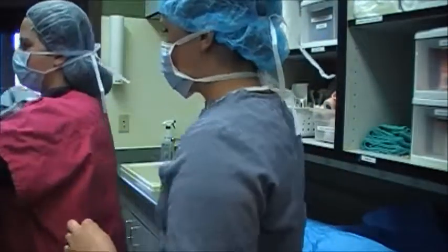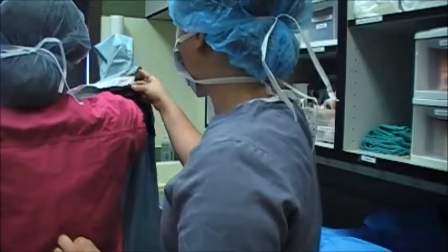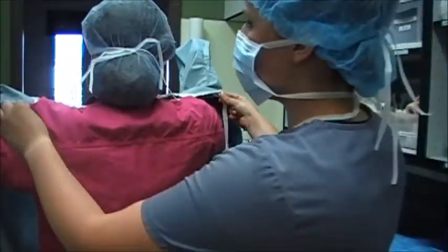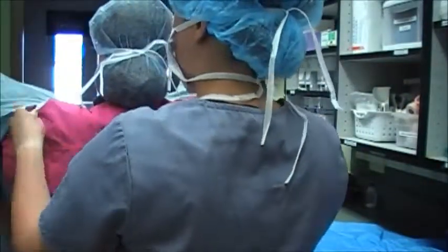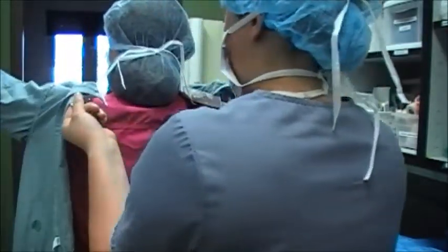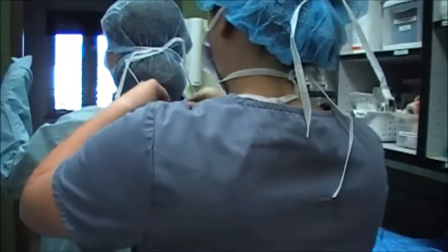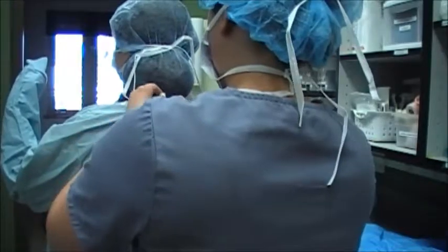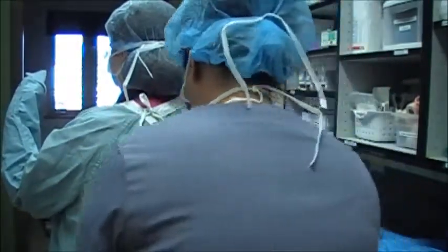When my doctor's ready, I'm watching her sterile field — I'm her monitor for surgical technique. Then I'm grabbing the straps of the gown without reaching into the front of it. I'm just touching the straps and the inside of the gown, not the outside. I can work that up over the shoulders and then tie in the back.